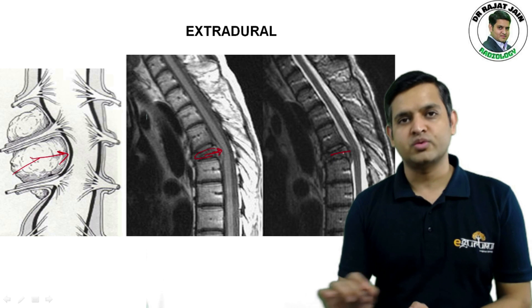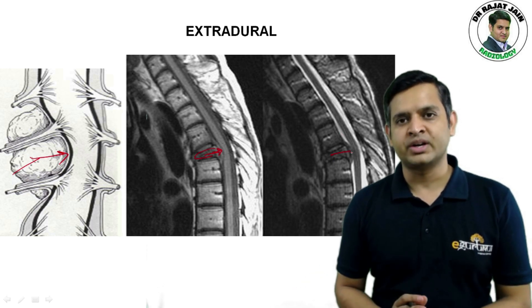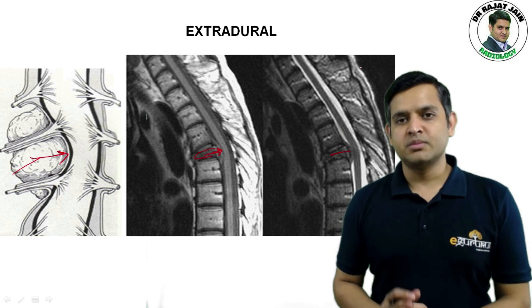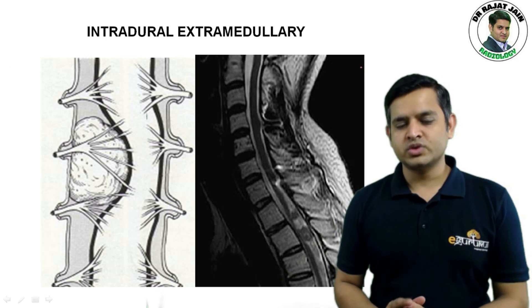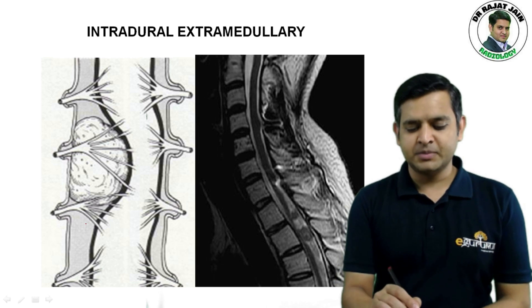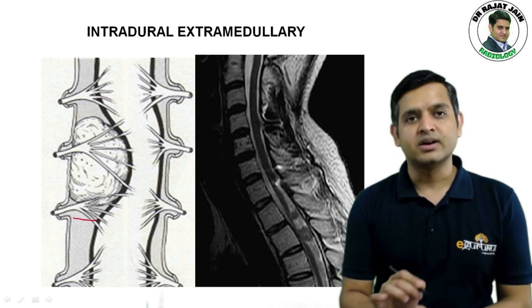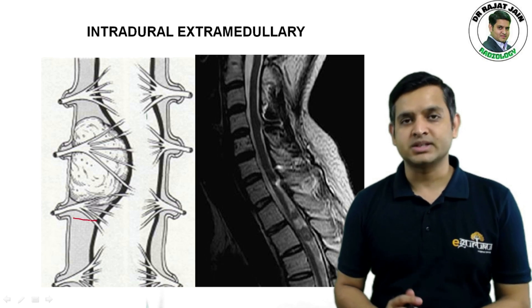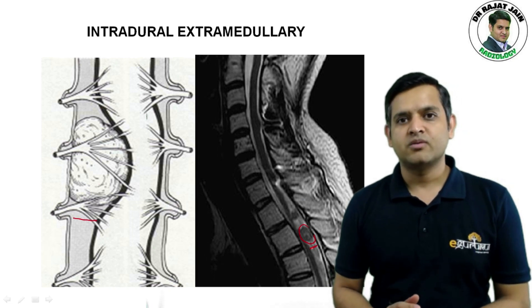This is very well seen on this T2 weighted MRI where the ventral thecal sac is obliterated. It is to be noted that the most common extra-dural mass is metastasis. An intradural extra-medullary tumor is present in the subarachnoid space and causes widening of the subarachnoid space, which is very well depicted here.